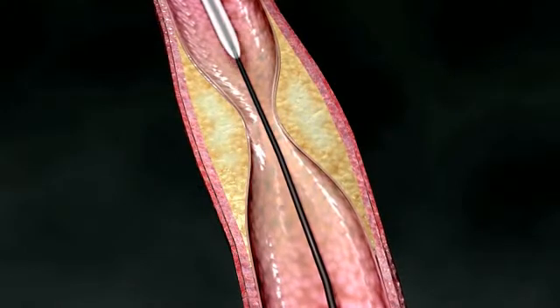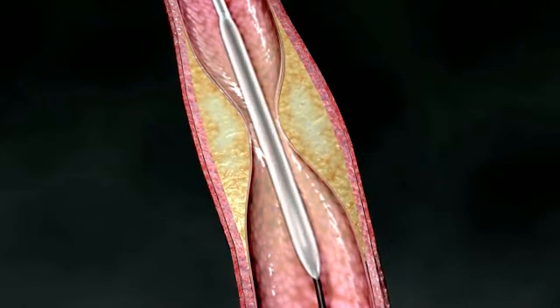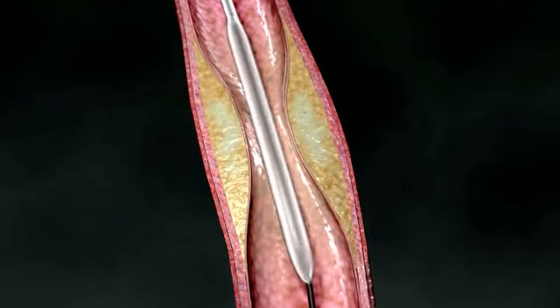After the location of the blockage is identified, the catheter with a small balloon at the tip is then reinserted near the blockage or the narrowing in the arterial wall.